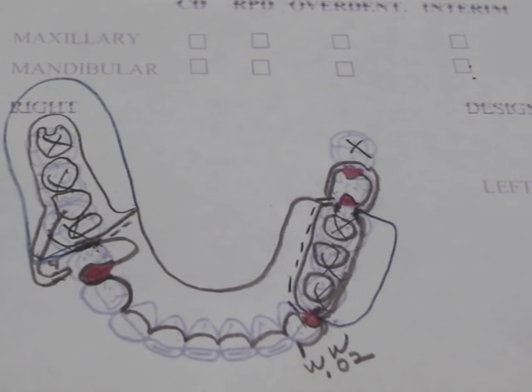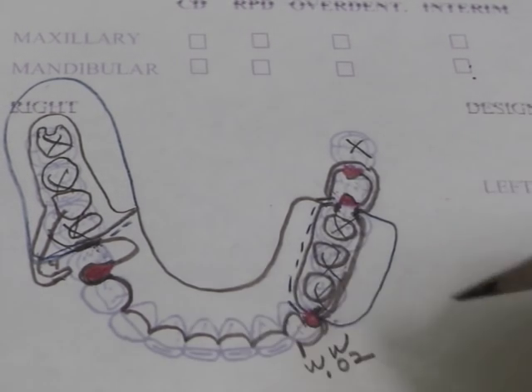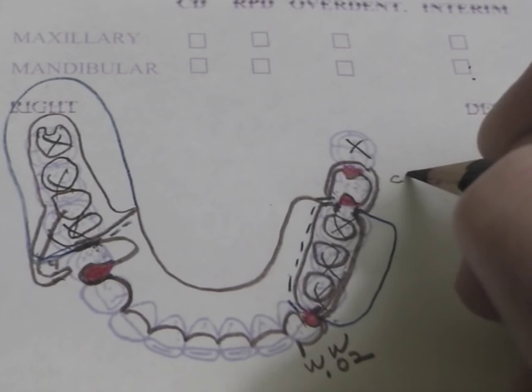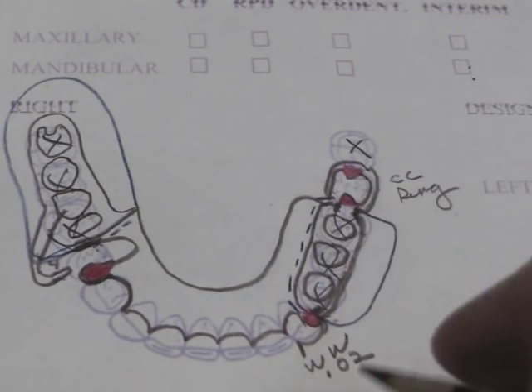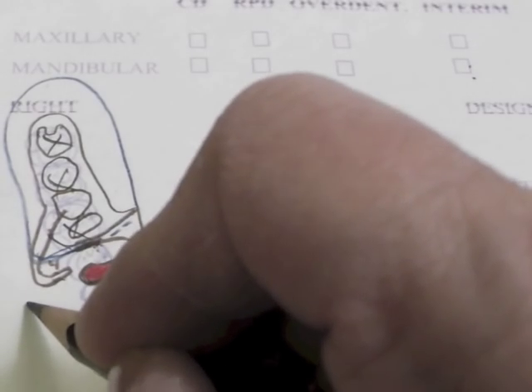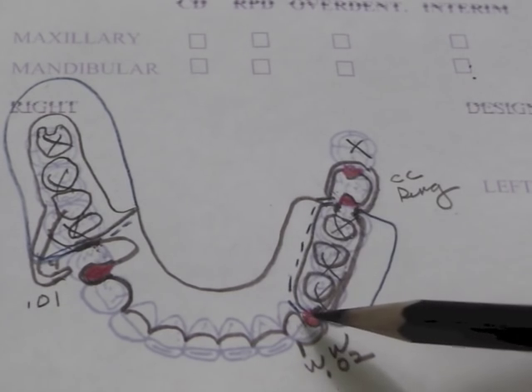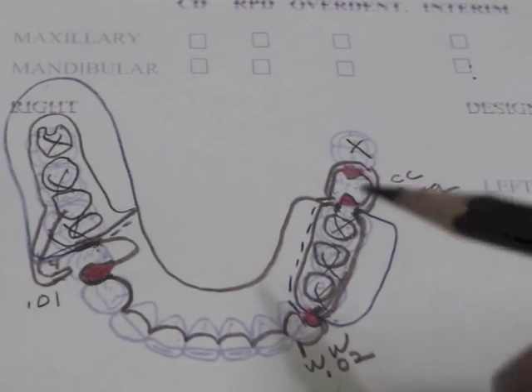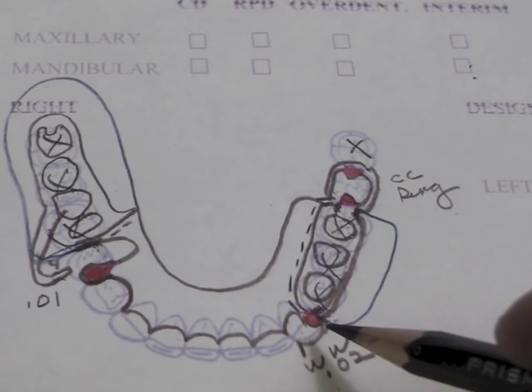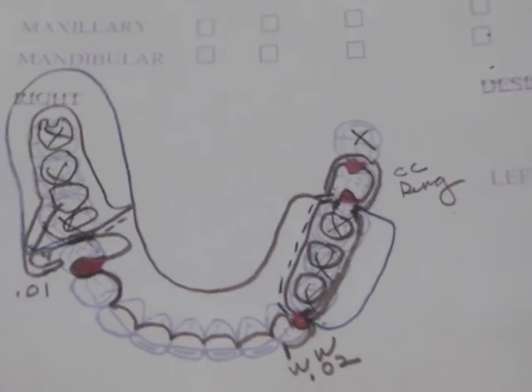I'm going to give myself some little notes: cast circumferential ring clasp here, wrought wire to a .02 undercut, I-bar to a .01 undercut. Other things you might want to note is if you would do tube teeth in this area instead of base attachment, or if you were doing an acid etch cingulum wrap. We have some other designs that we could possibly use on this, and I do want to present those to you.